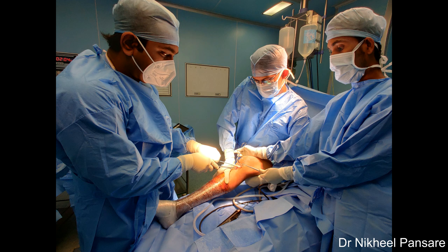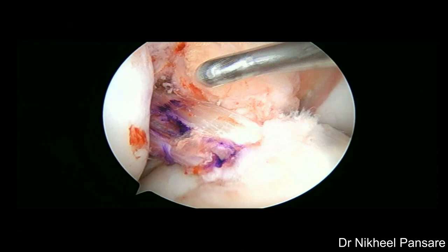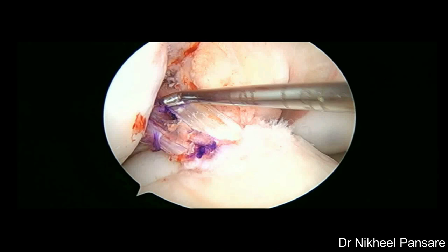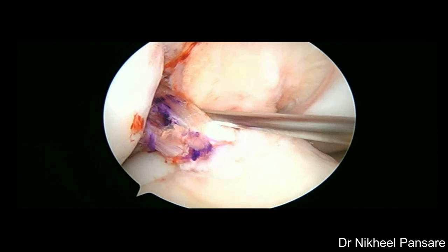Gentle cycling is done and graft is fixed into the tibial tunnel using interference screw over guide wire. The knee should be flexed at 30 degrees with assistant giving posterior drawer and surgeon pulling graft while passing the screw. This is the final graft placement in anatomical orientation and with proper tension. Graft is nicely coming out of the preserved ACL stump, which helps in neovascularization of graft and also retains some proprioception properties.